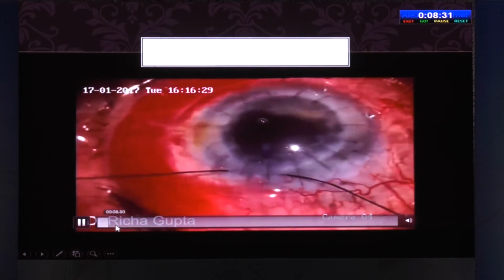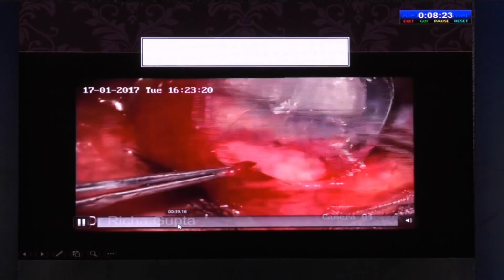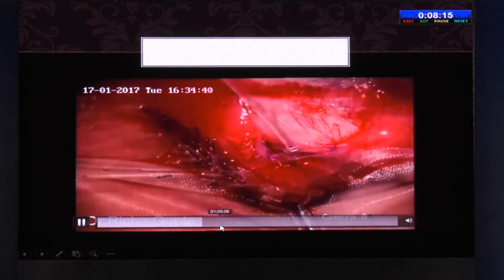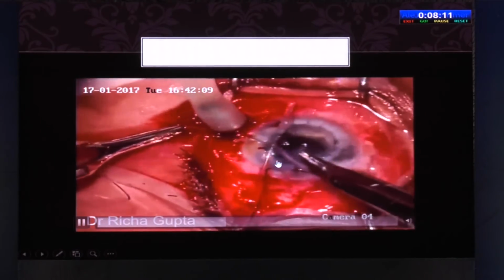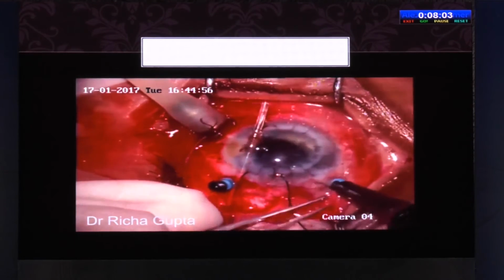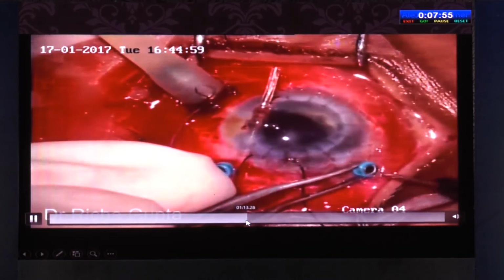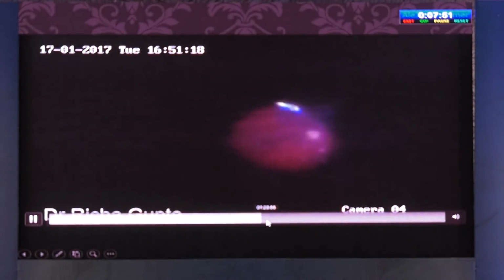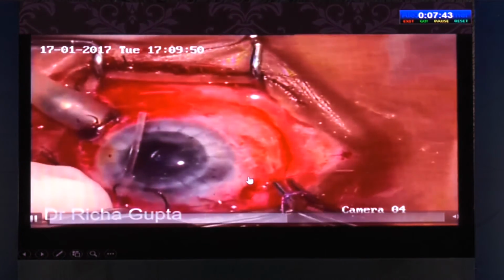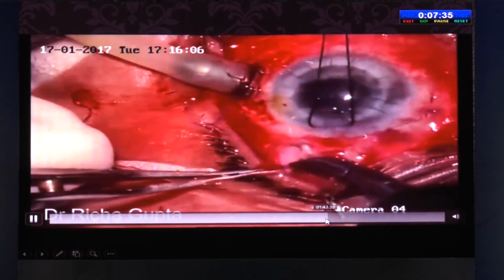This is how the eye looked. This is the corneal traction suture. The conjunctiva is opened, cautery done. The AGV is primed and is placed in the conjunctival pocket. The plate is sutured to the sclera, and this is the vitrectomy being done. The lower one is the infusion cannula with a 20 gauge needle, and the superior ones are 25 gauge cannulas. Complete vitrectomy was done with base excision. And the tube was cut and inserted into the vitreous cavity.